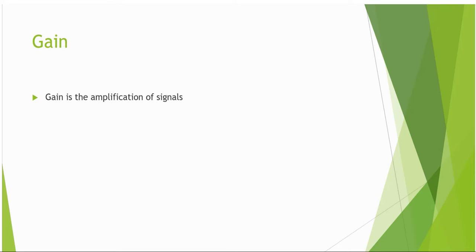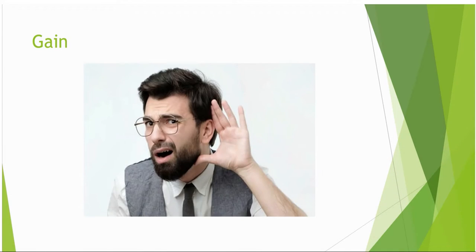So why is gain important? For a good number of reasons, some of which are more obvious than others. Its main purpose is so we can actually see what's being imaged on the screen. Again, a fairly simple principle. If everything is too dark, we won't see our structures of interest in the exam. Turning down the gain means that returning waves received with a certain low signal strength or amplitude will not be displayed on the screen.